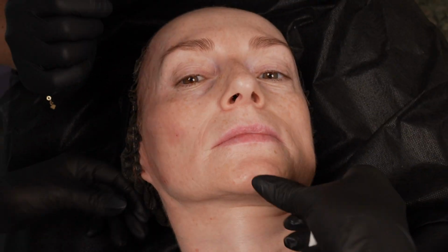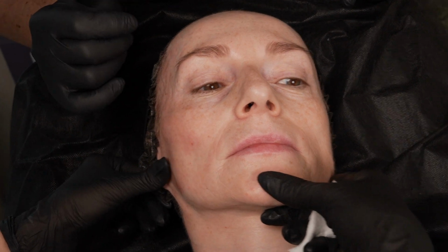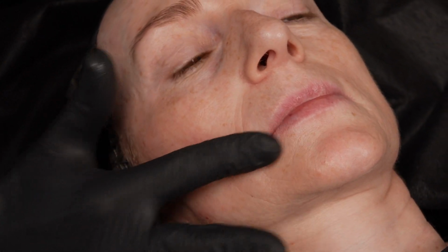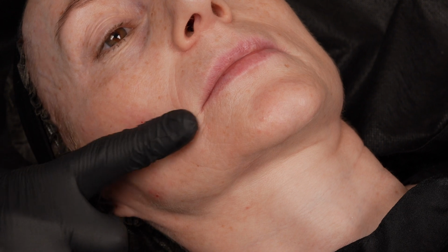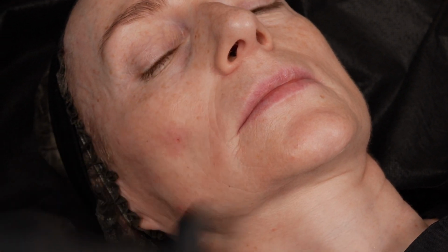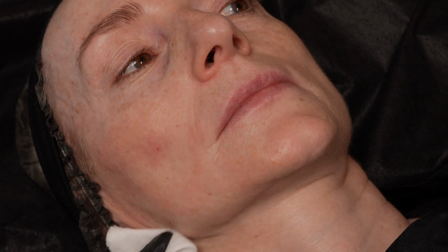So, what is the plan? I think my plan, the next step, we can open from here. We can also fill marionette. You can also fill a little bit pre-jaw, the same entry point. You can fill like this. You can fill here. You can fill a little bit. That's beautiful. Okay.